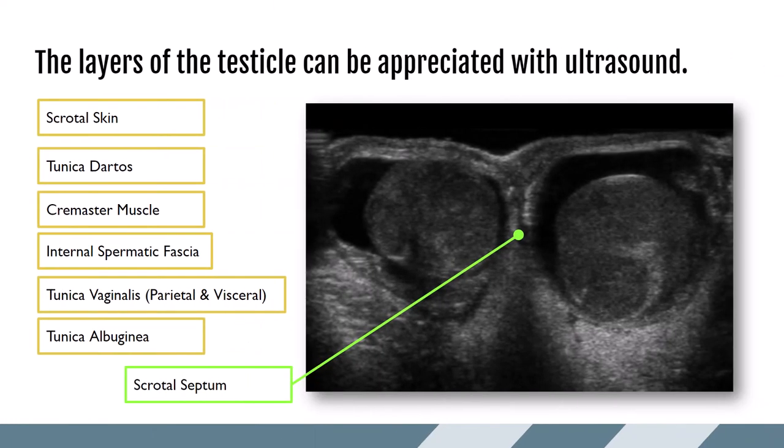Let's take a look at the anatomy under ultrasound. The layers of the testicle from outer to inner are: scrotal skin, tunica dartos, cremaster muscle, internal spermatic fascia, tunica vaginalis with parietal and visceral layers, and then the tunica albuginea. They are all appreciated in ultrasound images, but they're not necessarily the focus. Typically we might evaluate for scrotal skin thickening or fluid between the layers of the tunica vaginalis, but they're not structures we take dedicated pictures of — they're always just kind of in there.